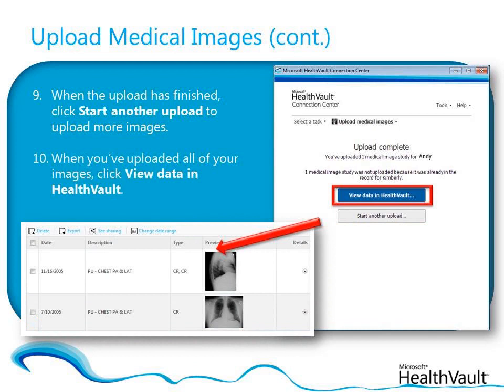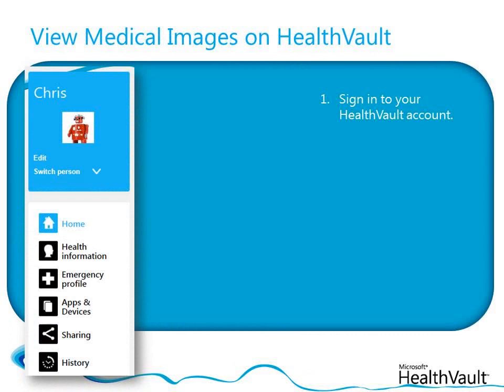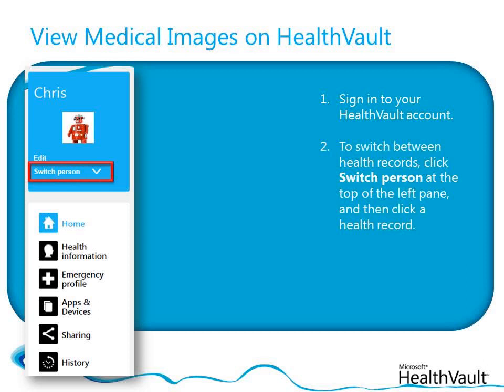You can also view your uploaded images by opening your HealthVault account directly. Sign in to your HealthVault account at www.healthvault.com. At the top of the left pane, you can see whose health record you're currently viewing. To switch to a different health record in your account, click Switch Person at the top of the left pane, and then click the health record you uploaded the medical images to.